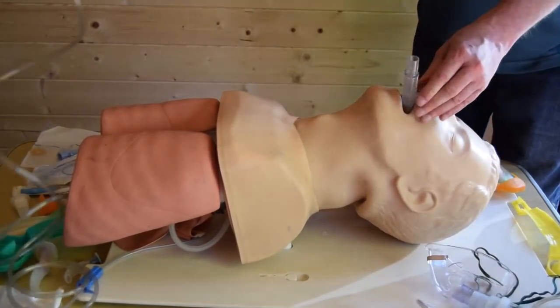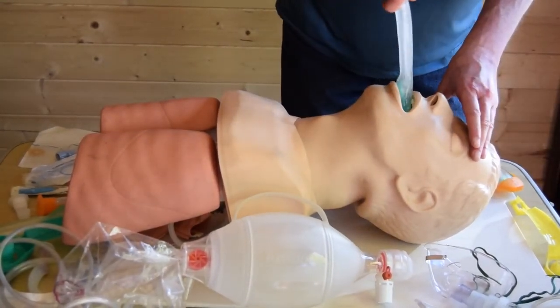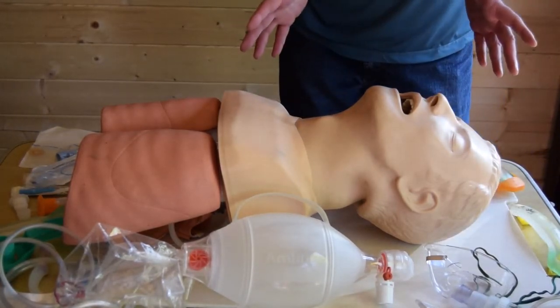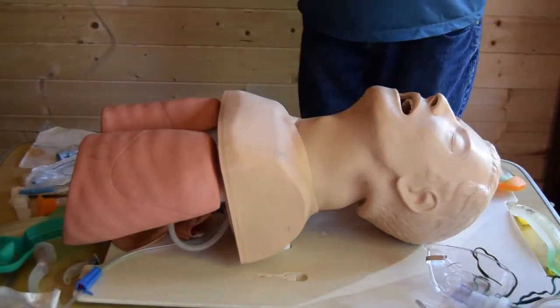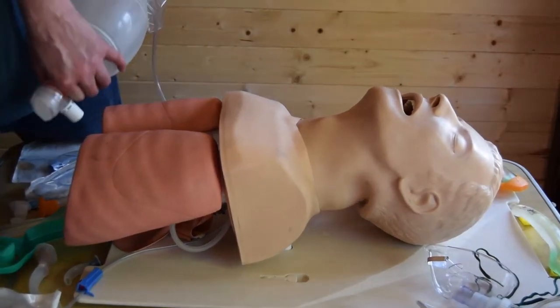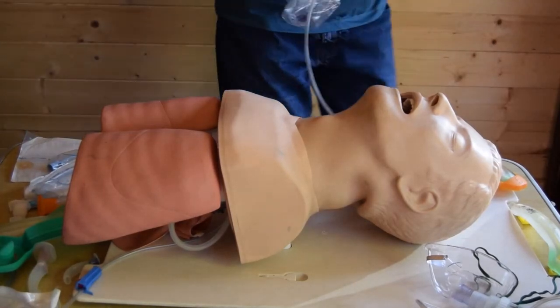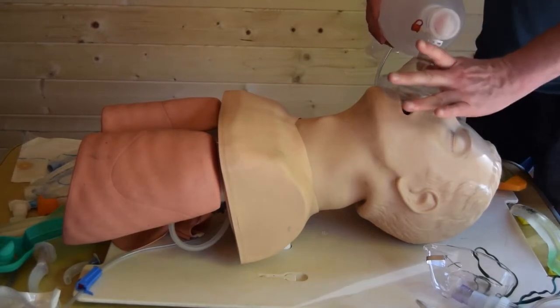I'll just remove this airway, same way as it came in, it just slips up the throat again and to one side. So those are 3 basic airway manoeuvres. Again, if we don't have an airway in situ, we can get the BVM placed over the casualty's mouth.